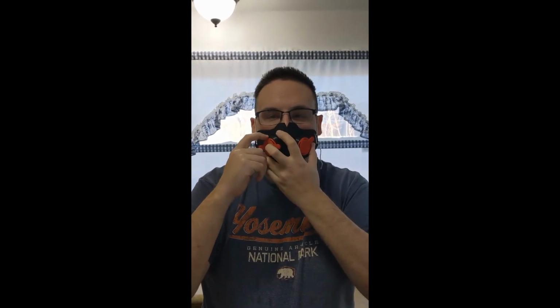Breathability right now is okay. So breathability is okay, but already I could tell this would be a very uncomfortable mask to wear. It doesn't breathe at all. The two vents will let in enough air, but if you're running around and doing a lot of heavy work, this probably would be hard to breathe through.